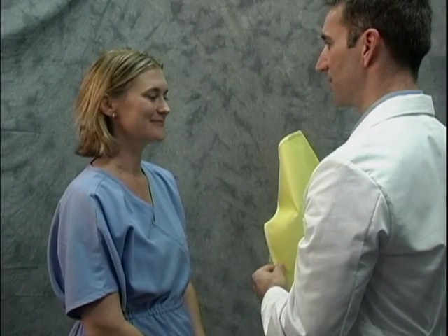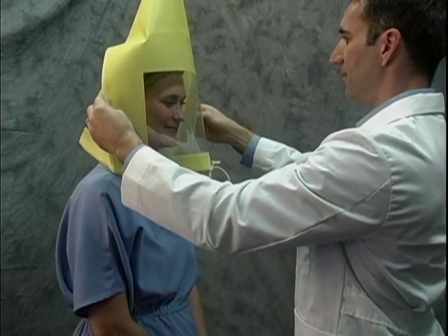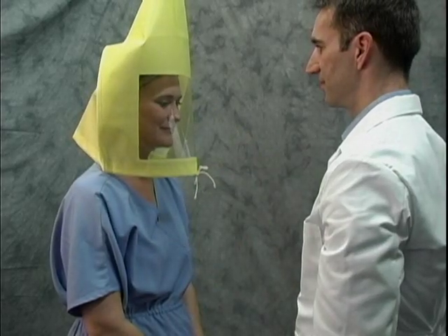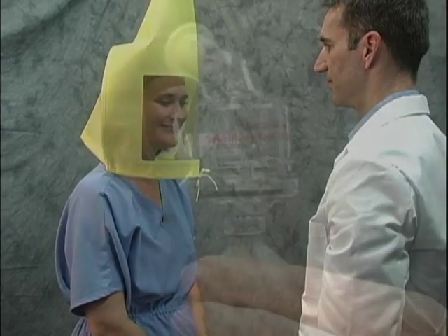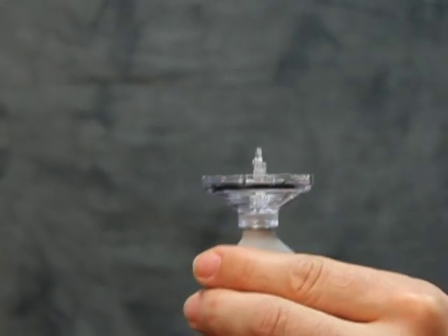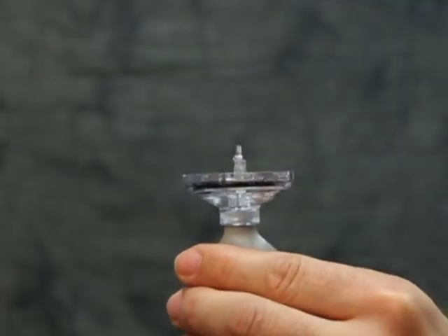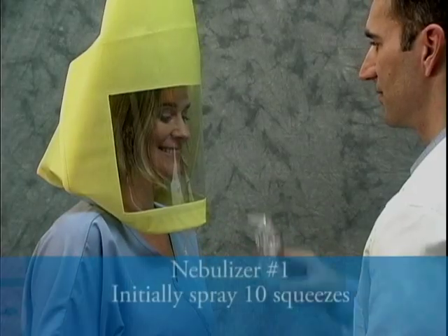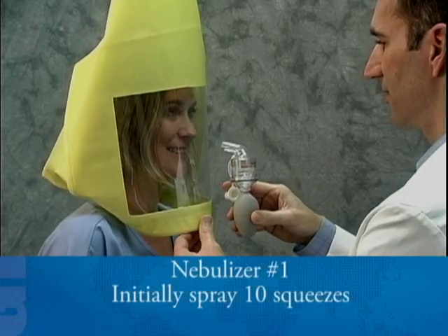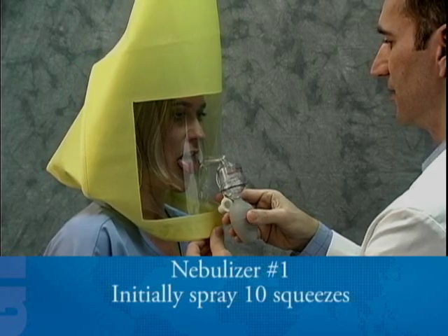Your instructor will place a hood over your head, positioned so there is about six inches between your face and the hood window — this allows free movement of your head. Unscrew the top of nebulizer number one and pour in a small amount, approximately one tablespoon, of the sensitivity test solution. Using nebulizer number one, the instructor will initially spray ten squeezes rapidly through the hole in the hood window.